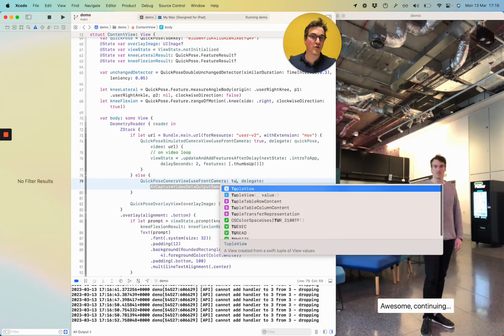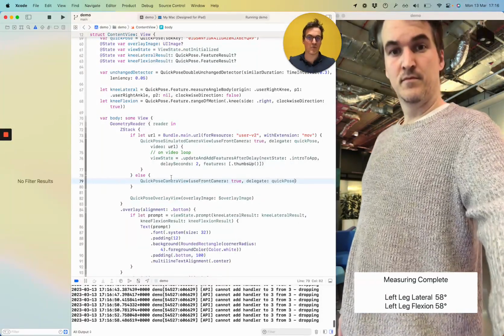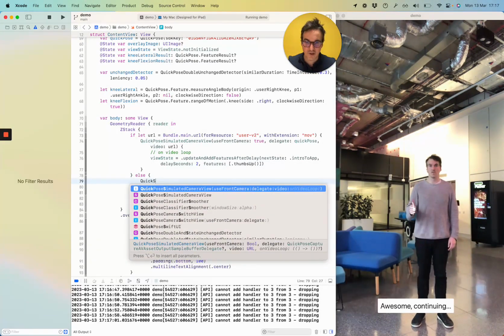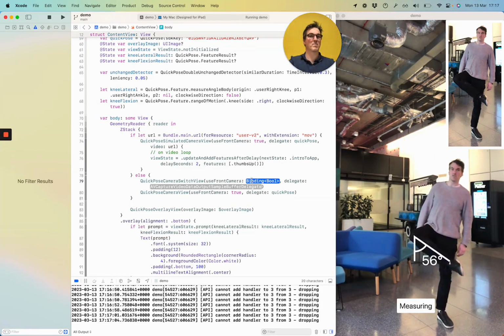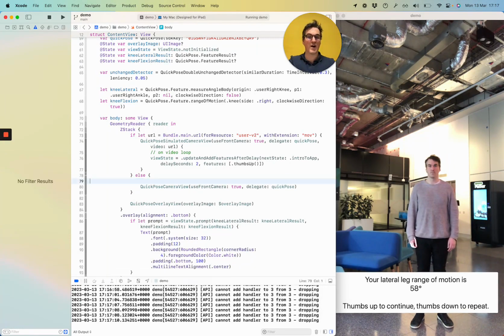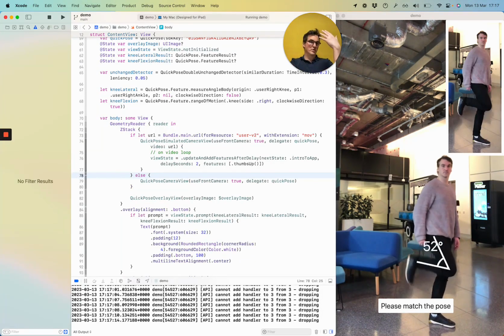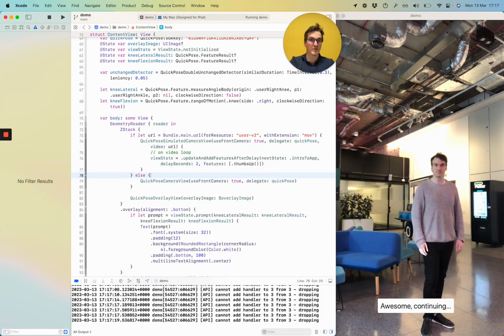There's a choice here whether or not you use your camera's front camera or back camera. We have a different view to allow that. So it's a QuickPose camera switch view here. So you can pass in a binding to swap between the two cameras. You might find that your use case requires someone to be filming someone else, so you'd use the rear camera for that. Say, for example, in sports, you wouldn't expect someone to be carrying an iPhone and filming themselves.